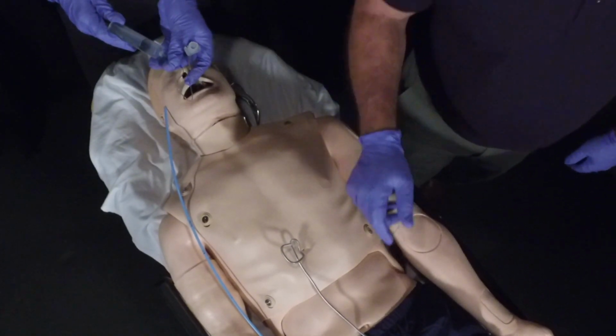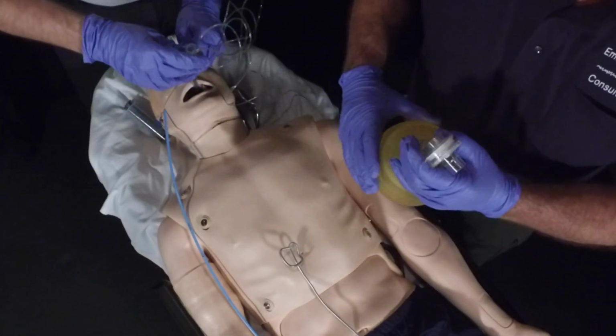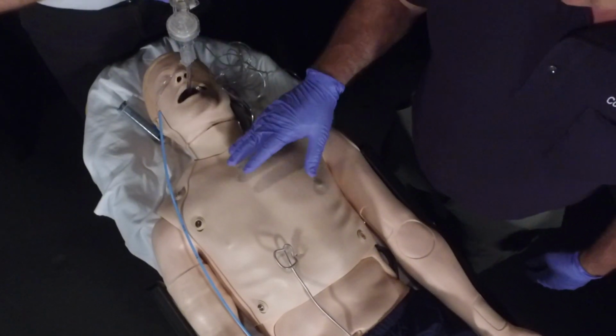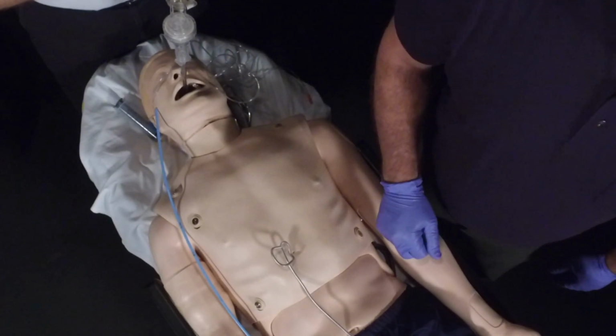At this point, inflate the cuff, use your end tidal CO2, bag valve mask, listen to epigastric sounds, lung sounds, chest sounds, end tidal CO2 monitoring just like you would with any other intubation.